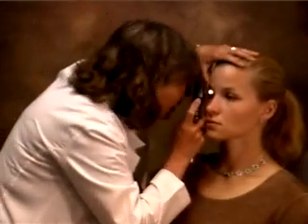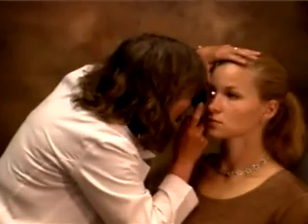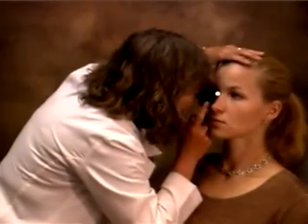Another way to do it is to put my thumb on her forehead and then rest my ophthalmoscope right on my thumb. And I'm seeing a beautiful picture of her optic disc.